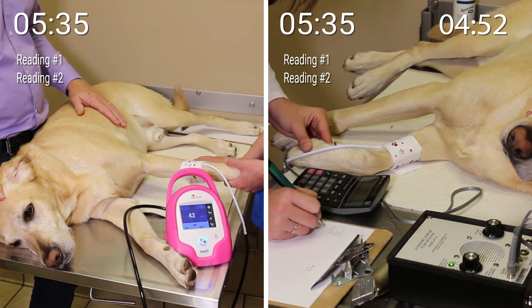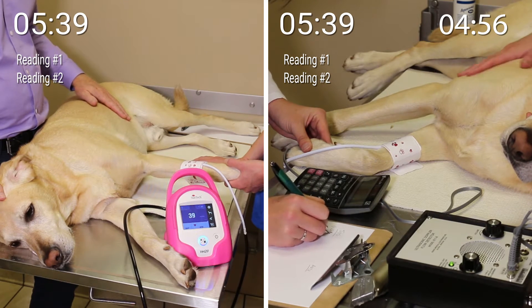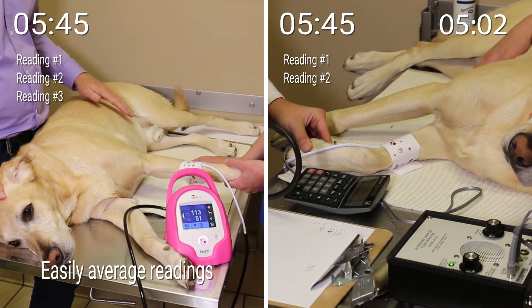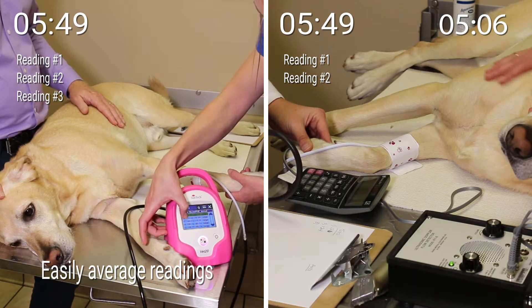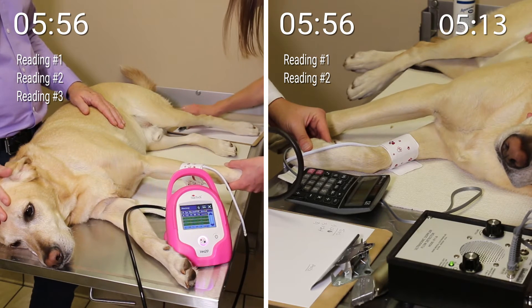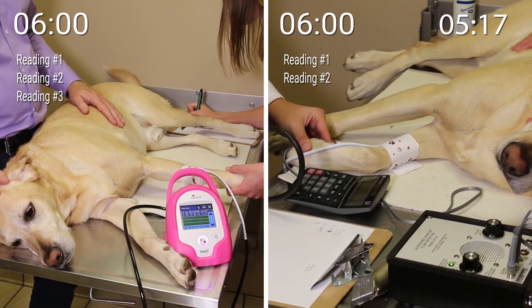On the left side, you can see that the technician is just about to complete the last of three BP measurements with the VET20. Next, she will access the device's memory, tap on each reading to select it, and then hit the Average button to easily get the average of the three readings. Now all she has to do is record this value in Tucker's chart, take off the BP cuff, and power down the device.